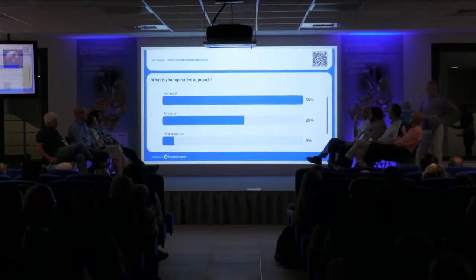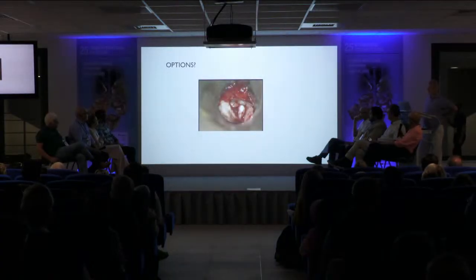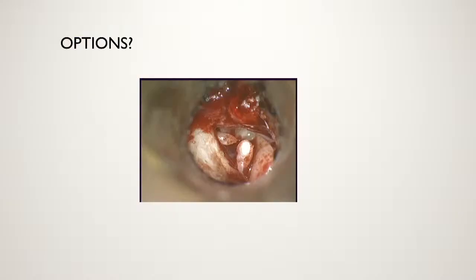But the whole cost of that for the self-pay patient is thousands, isn't it? It is thousands. So do you think the 400 makes much difference? I don't know. You could certainly argue it doesn't make much difference. But you're going to put some cartilage on top of that. Yes. Okay. It's quite a small defect. Let's just go on and have a look at it. That's what it looks like when you lift it up. So we're going to go to, I think, let's go over to Saji, to Brazil.